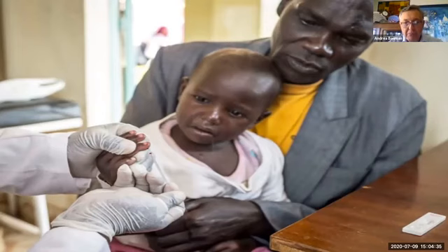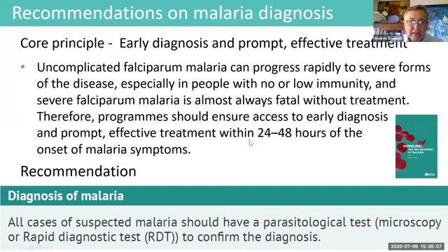This is the most precise way of taking blood from a finger prick, because it really has a very specific volume. And so if you can, when you select RDT, select what we call ancillary items. This is really the best blood collection device. Okay, thank you for this. Trying to move to the next.